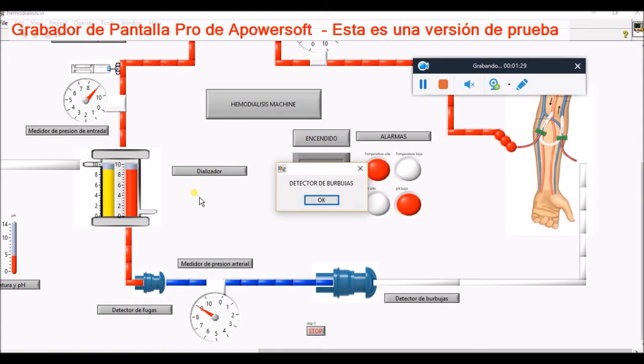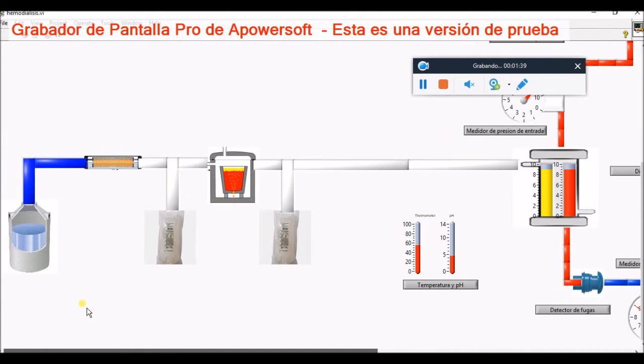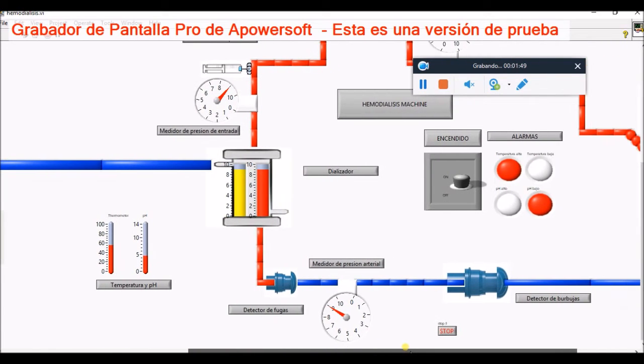They can be inserted at the bedside under sterile technique, preferably with direct ultrasound, with Doppler or fluoroscopy, by an experienced practitioner to ensure accurate central placement. They are sutured into place and secured with a sterile occlusive dressing.